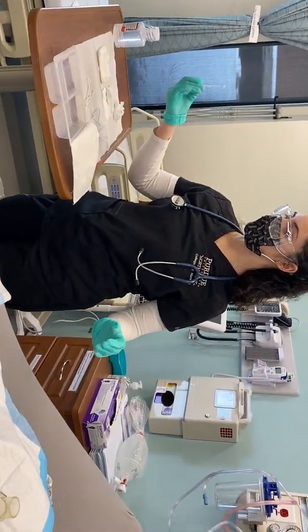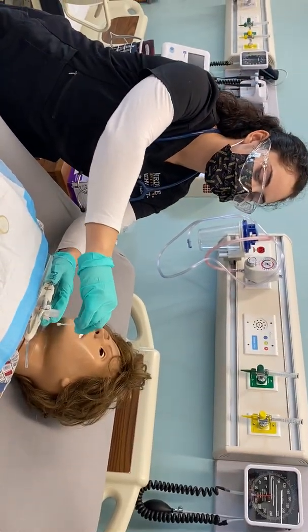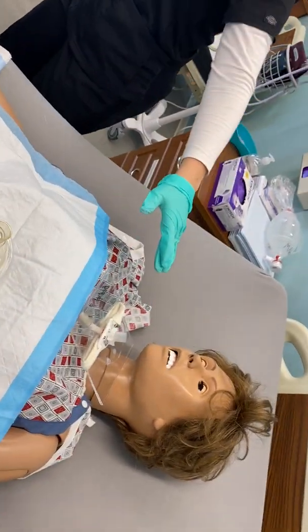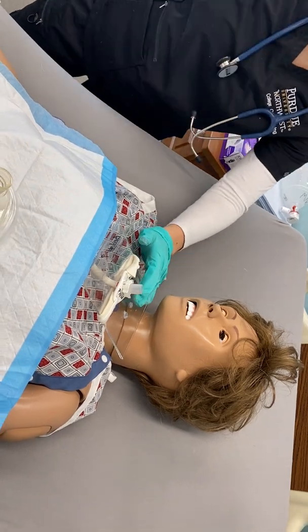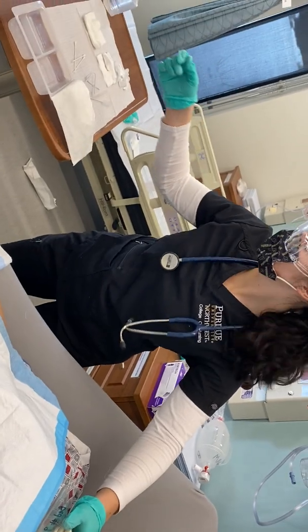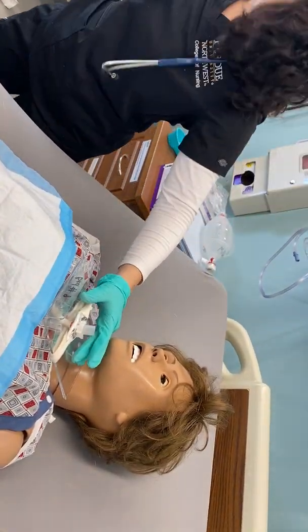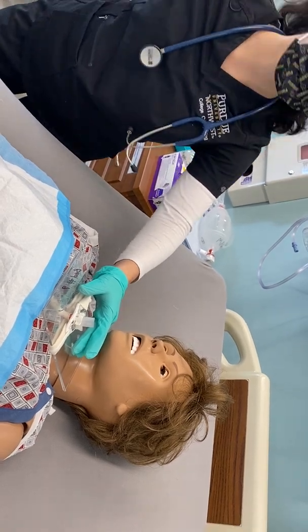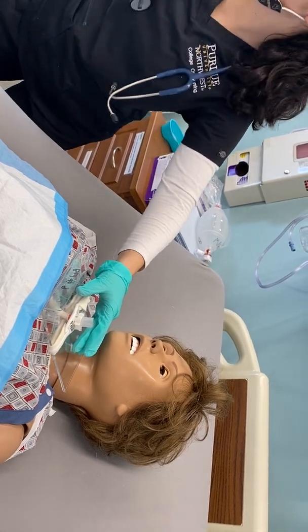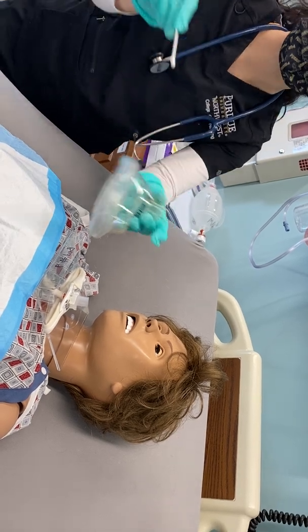Now I'm also going to be taking with my sterile hand the Q-tip, dipping it in the saline solution, and going around, discarding it. Now I'm going in the saline again, coming around, cleaning it, discarding it. Going in the saline, coming around again, discarding it. Going in the saline, coming around one more time, discarding it. And since I have one more left, I'm going to clean the oxygen mask. Sometimes it gets a little dirty in there.